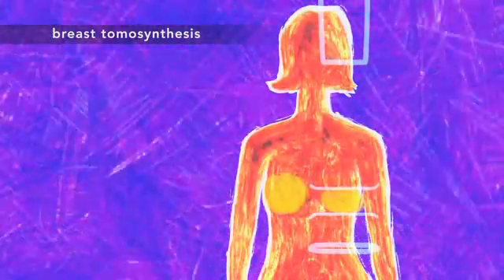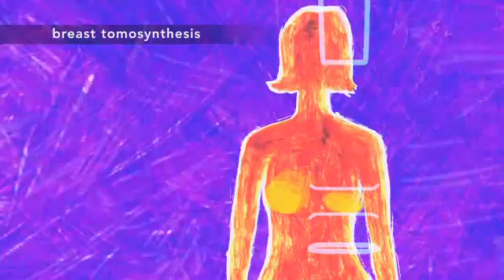The 3D exam looks and feels like a regular mammogram, only it takes a few seconds longer for each view.